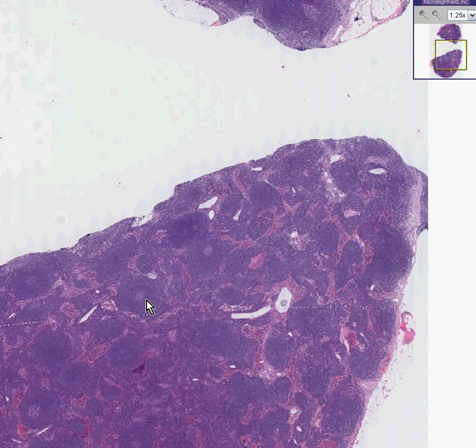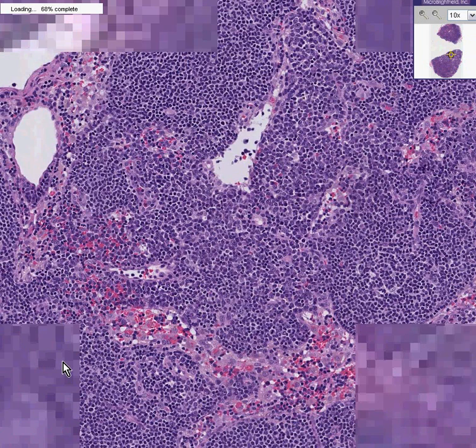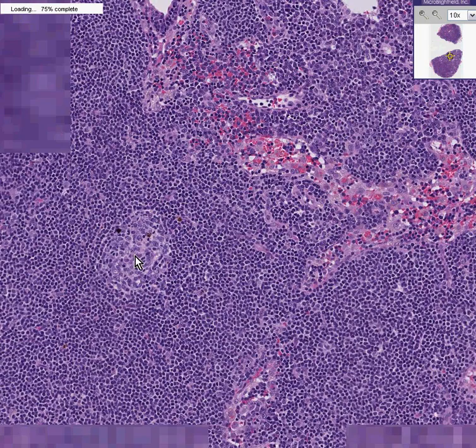If you go and look at a lot of these lymph nodes, you'll see in almost every one of these nodules a germinal center with a proliferation of the immediate groups of cells surrounding it. Let's take a look at them, although they just look like normal lymphocytes and without special stains or markers, you really can't say much more.